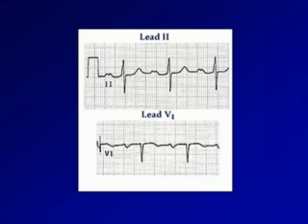This is an example. You see a very broad P wave. It's almost 160 milliseconds, with easily distinguishable camel humps, dromedary or Bactrian, I can never remember which. Maybe one of you can.